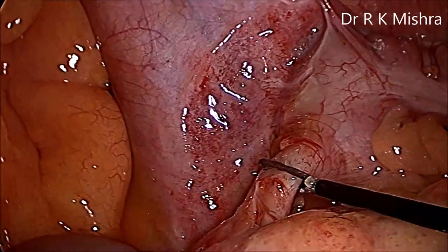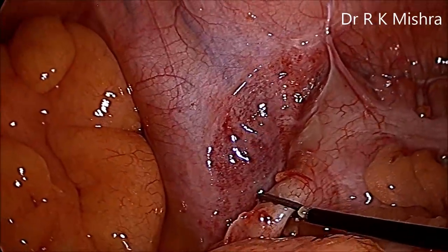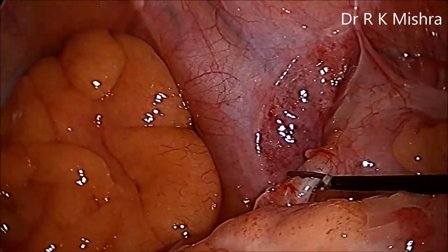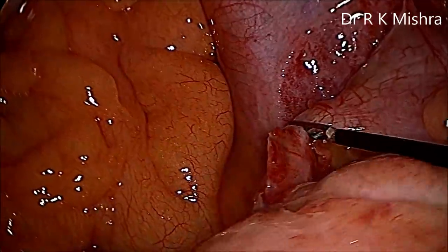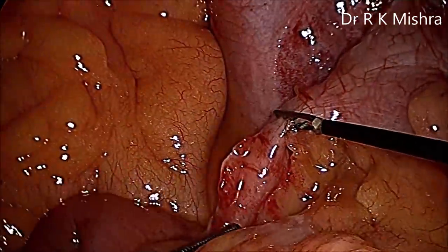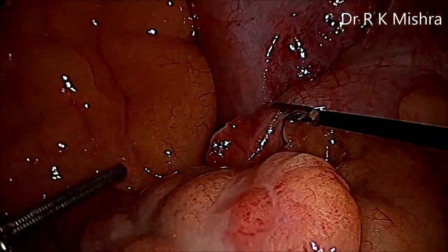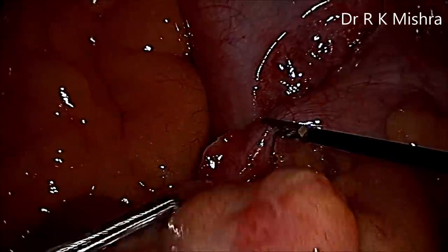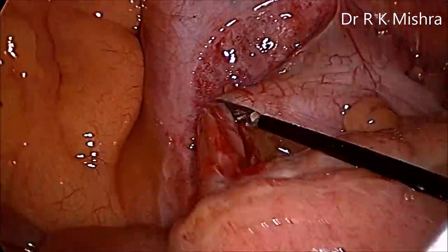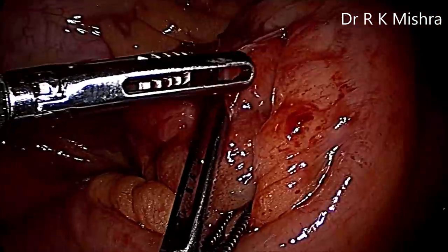This is the base of the appendix, which is correct. It's not very much necrosed, but the tip of the appendix and the body of the appendix are fully inflamed. It is completely adhered to the small intestine. A lump has been formed. You can see a lot of phlegmon. And this lump is edematous, but it is not matured. So it is good to perform at the appropriate time.